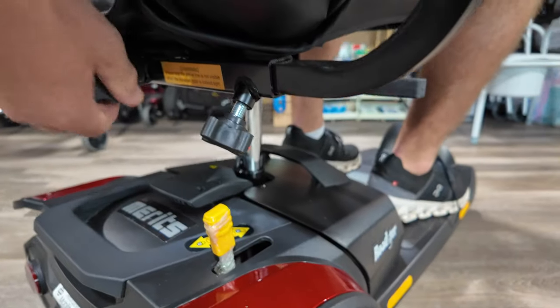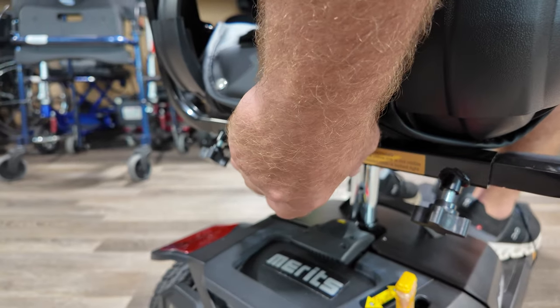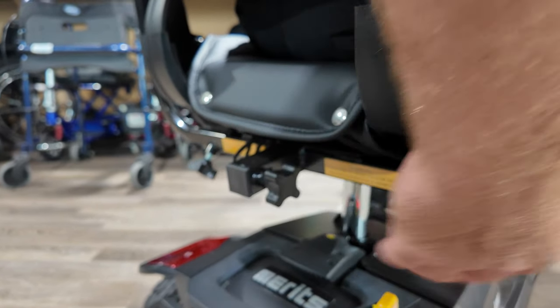You have your port back here for an oxygen tank, a basket, a walker holder, and stuff like that.